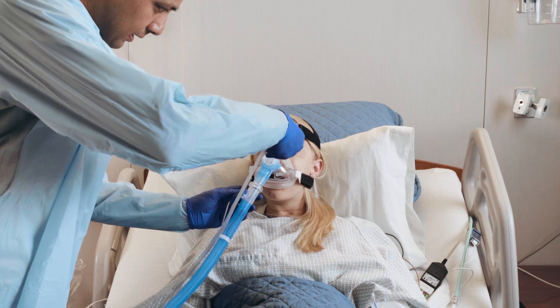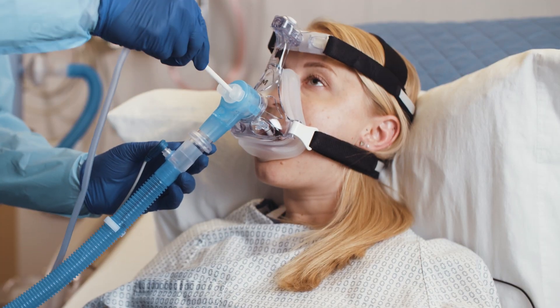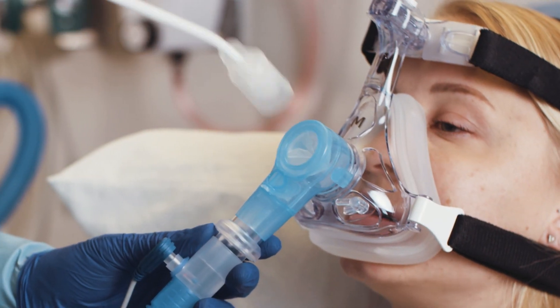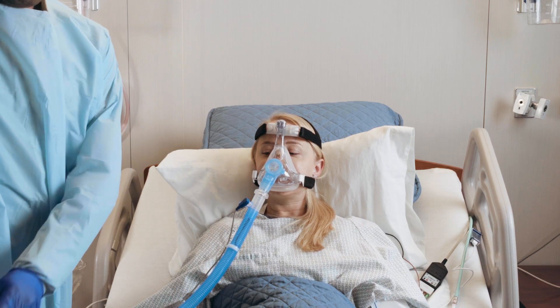When finished, remove the appliance by gently pulling on the stick to retract the sponge or toothbrush into the protective guard and continue pulling until the appliance slides out of the elbow.